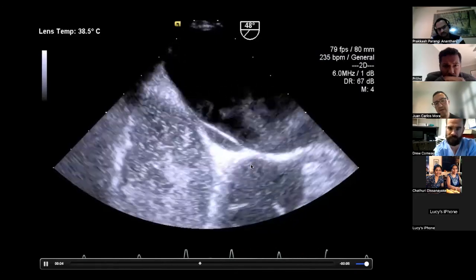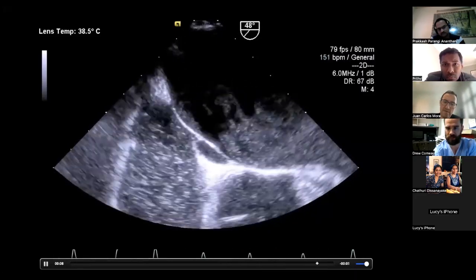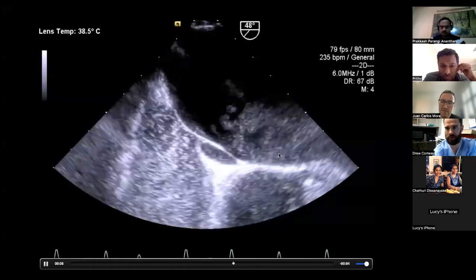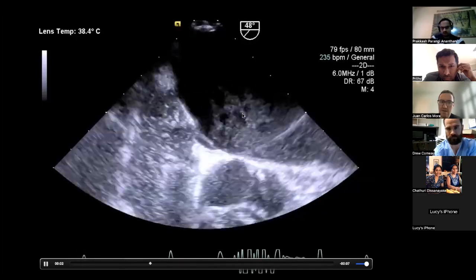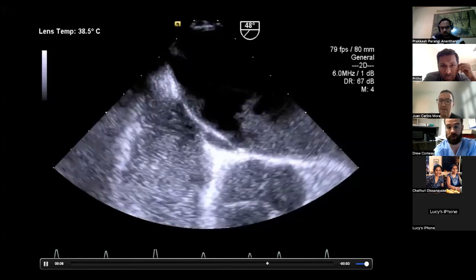So all this stuff you can see in the left atrium is done from a Siemens TOE probe, and Siemens often use quite high powers on their probes. All this stuff that you can see in here, on other images there wouldn't be anything. So I don't think we are seeing connections going across. This is just Siemens, which often makes normal looking flows look like there's a bit of smoke in there. All right, okay, thank you.